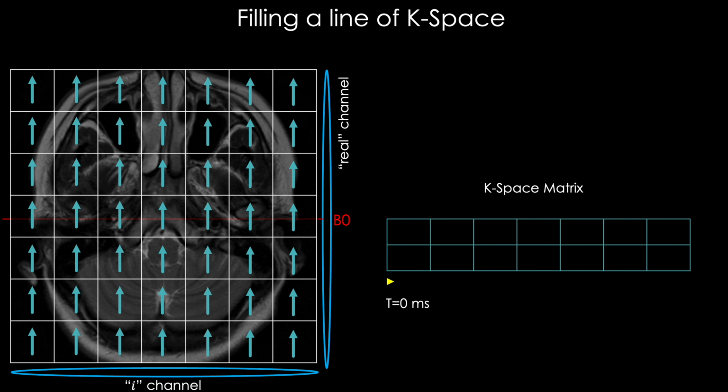To begin the process, we apply our initial RF pulse as usual, producing a free induction decay as described in the previous lectures. Then we'll generate an echo with another RF pulse or gradient field, not shown here. In reality, all of these magnets will be rotating in and out of phase with each other, getting more in phase as the echo starts to emerge, but visually let's pretend they're fairly well aligned going into the echo.